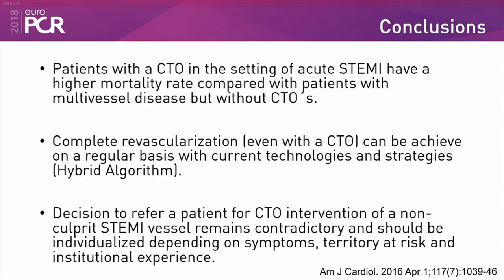Thank you. Just another point, Gustavo, before. You also did thrombus aspiration in this case, and you didn't in the previous one. So what's your point of view on thrombus aspiration, considering how the guidelines have changed? Well, we usually do thrombus aspiration, even though the trials said that there's no benefit in mortality and quality of life and so on.